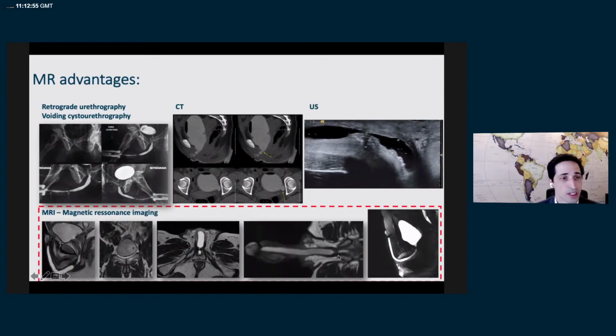and the right position of the stricture. It's good for seeing when you have multiple strictures, and you can clearly see not only the stricture, but also the soft tissue beyond, and the thickness of the fibrotic tissue involving the urethral stenosis. We can also use voiding images. This is in the sagittal plane. We can show the whole urethra and the patient's bladder emptying. At this point, we have the stenosis, and throughout all the images, we see this stricture permanently.